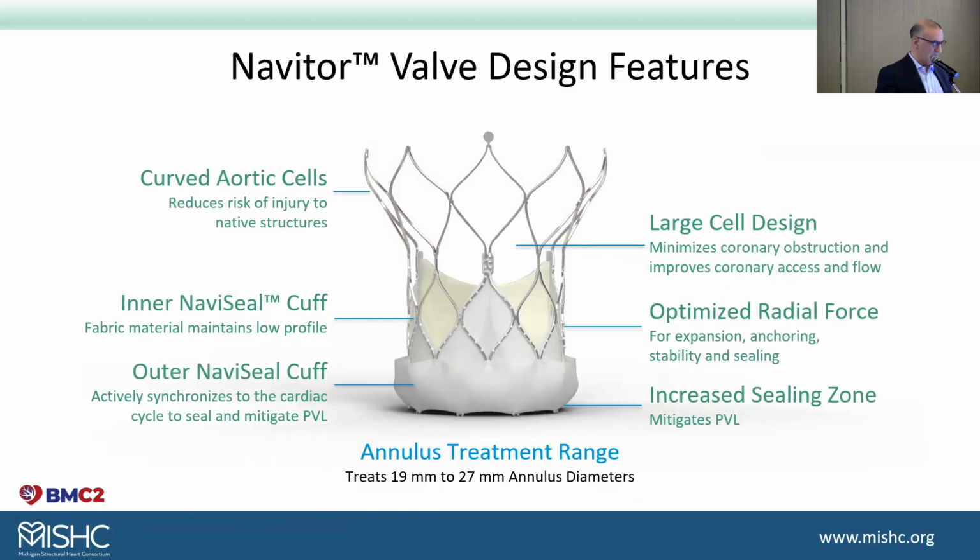And then the Navitor, for those of you who have not seen it yet, is on the market. It is kind of a mixture of an Edwards and a Medtronic valve, in that it is intra-annular, but has a frame. But these frames are much, much larger, dynamic, and much larger in size, so it creates an easier access for coronaries.